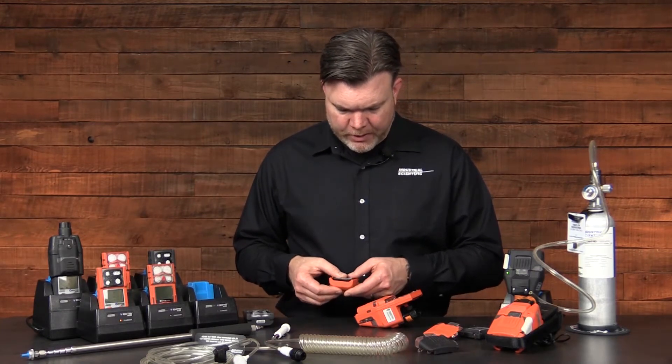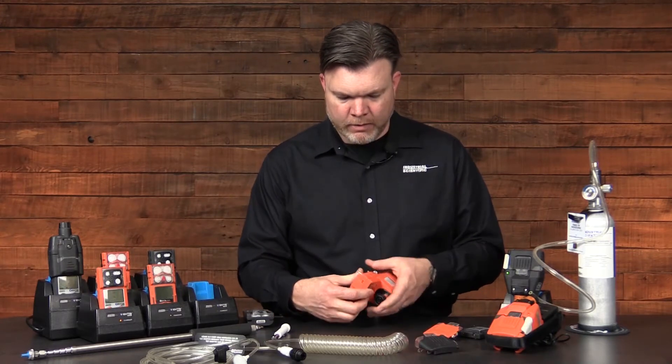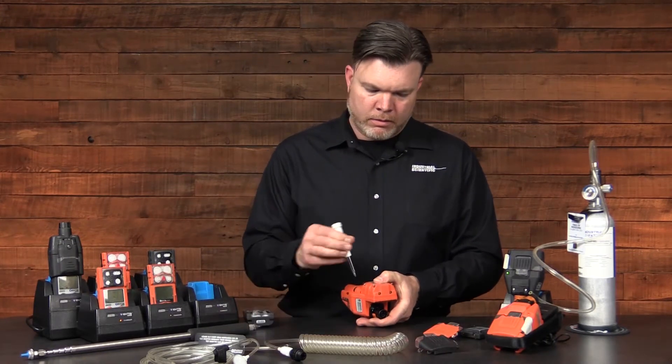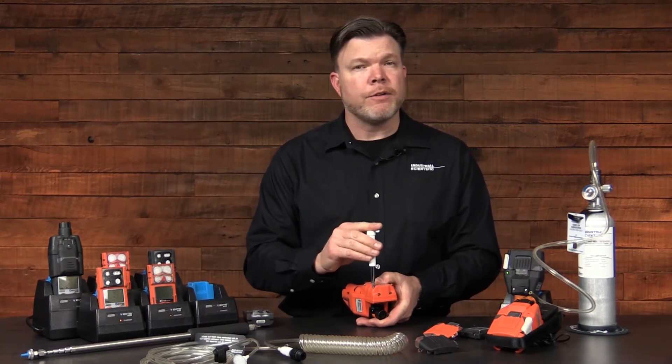Once your inspection is concluded, you can reinstall or replace your battery as needed. Hold the battery firmly against the slide-on pump and tighten down your four screws.